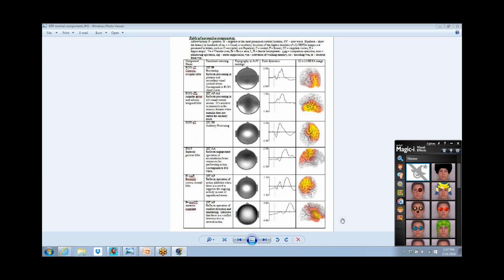Feedback of EEG can be done with independent components as well. In Europe, there are a lot of people doing ICA feedback. You predefine the component by analysis. Once you've defined the component, you can end up doing that as feedback. And that's an interesting approach because there are components that are transients that you really can't see.